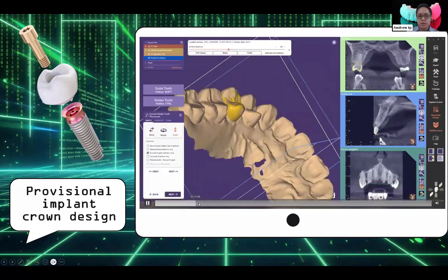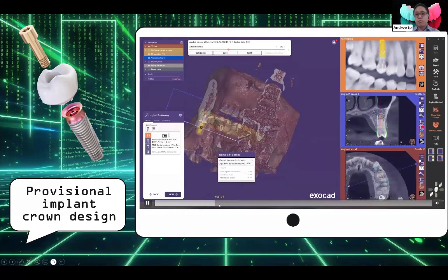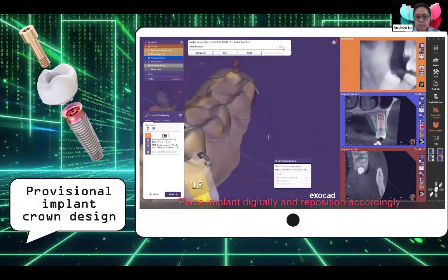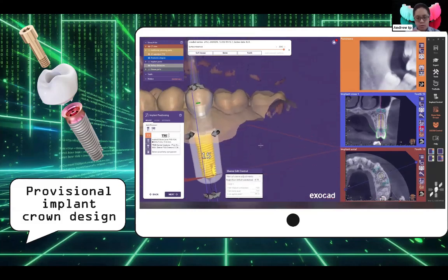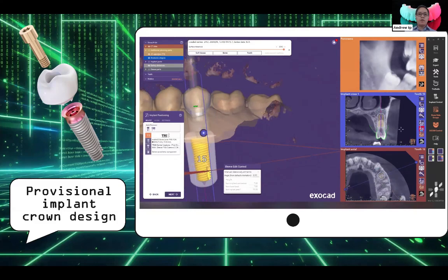Here we're just putting a basic tooth. Now we're basically placing our proposed implant. So this tooth actually had a vertical root fracture, which I'll show in the next slide. And once again, please note that this is all done beforehand. We haven't even raised a flap yet because this actually all has to be done under IV sedation.